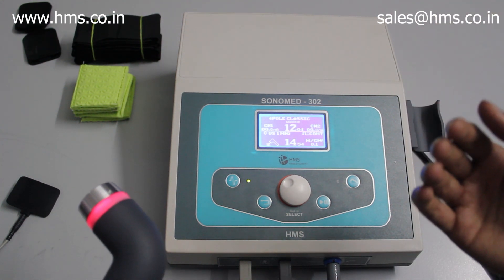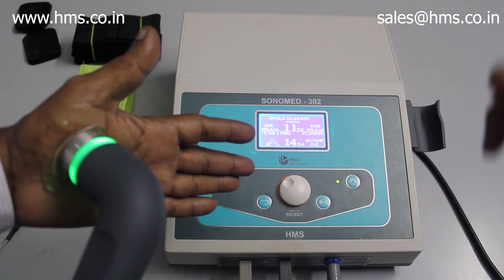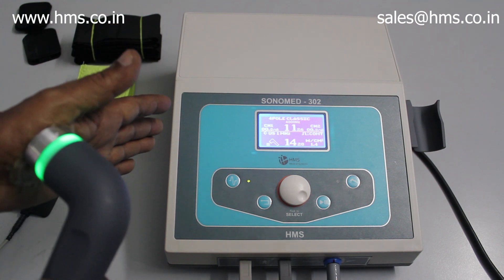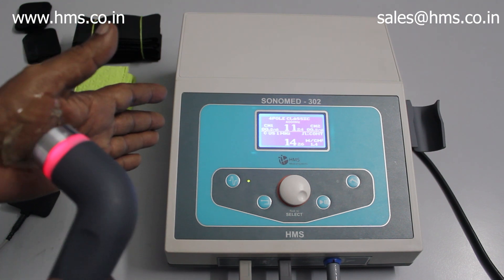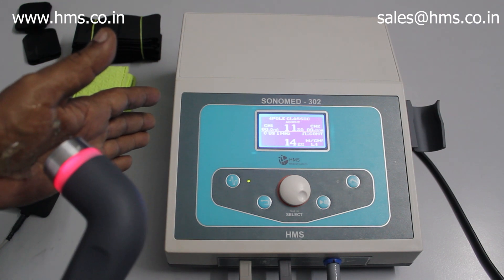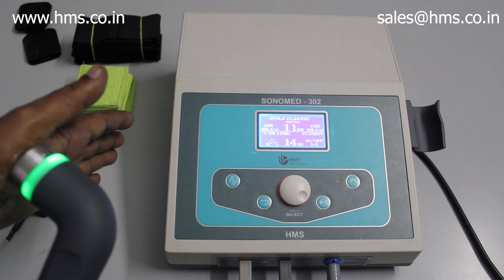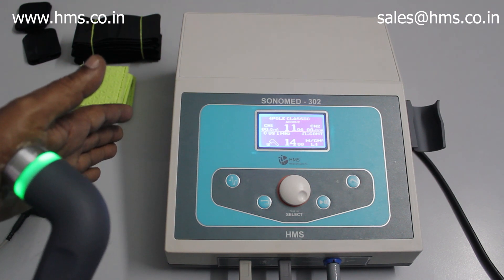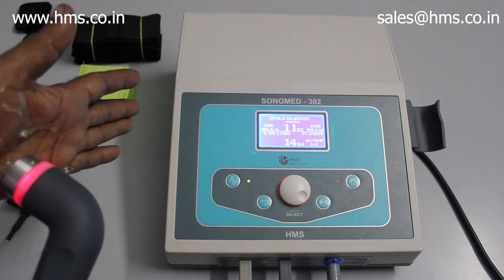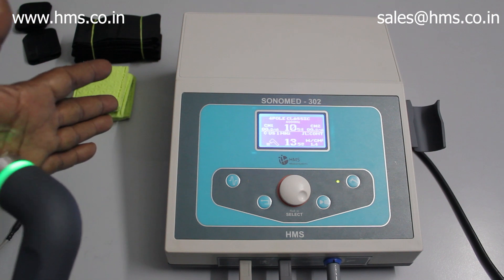Only when there is a sufficient amount of gel present between the transducer and the human skin will the treatment start. Now we apply some gel — with gel in place, the treatment starts. Whenever the output is active, the transducer turns green; whenever there is no contact between the transducer and the skin, the transducer turns red. This contact sensing feature is available for both electrotherapy and ultrasound therapy, and is the second main feature of the Sonomed 302.